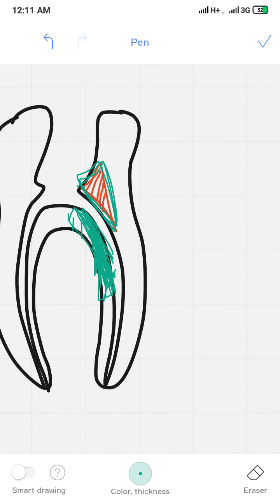There is also one danger, because with an endomotor you can use a brushing motion to engage the outer wall, but while using the file with your hand, it's difficult to force the file to the outer curvature.